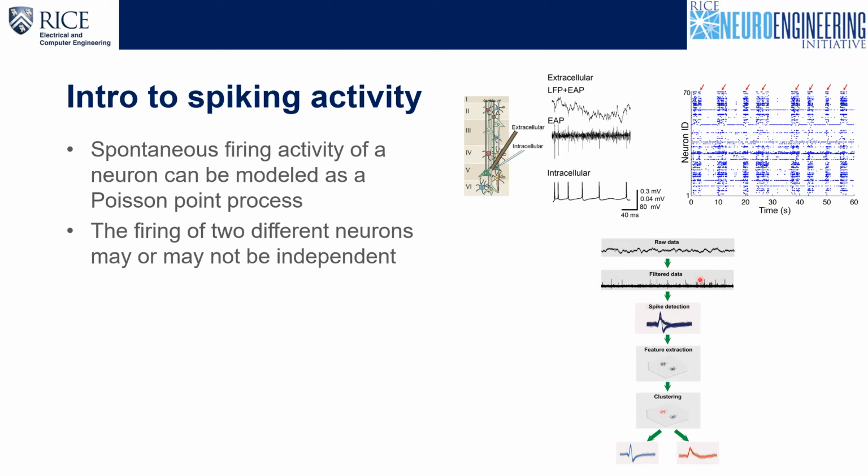So the way we do this is we have this raw data, we filter it, as I just mentioned, with a high pass filter. We then have all the spiking data. And then we do a threshold. You can just threshold this data with an amplitude threshold, so any spike would be above a certain threshold. So you would then detect all of these spiking events.